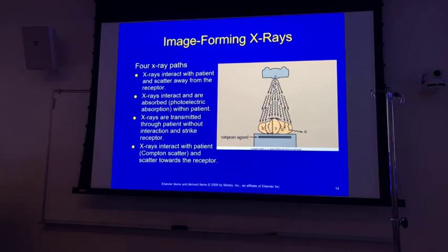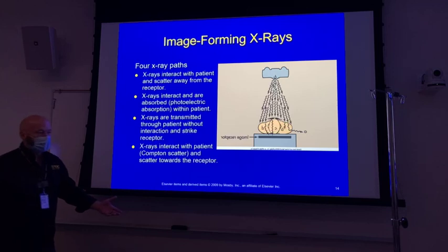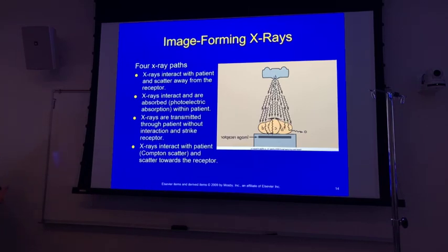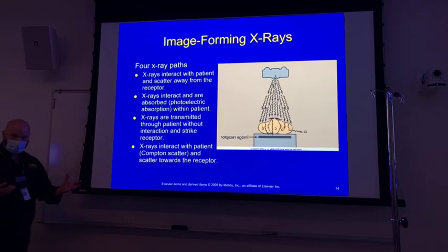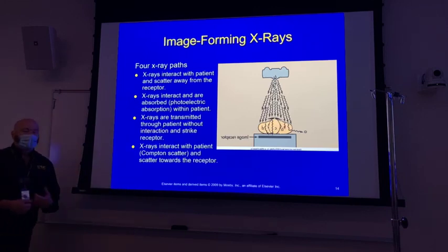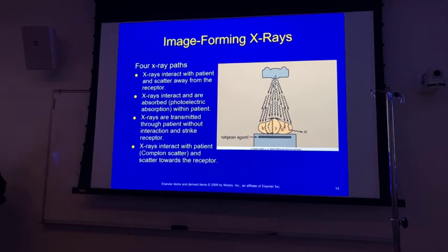So it got us thinking, okay, that was about 6 feet, and it was steeper than 90 degrees. Let's mock up a patient. It's going to move down right there. Take some water bottles. Let's shoot through just something that would create some x-rays, some scatter. Now let's see how much of an exposure we're getting behind the control panel. 10 feet away, 90 degrees.